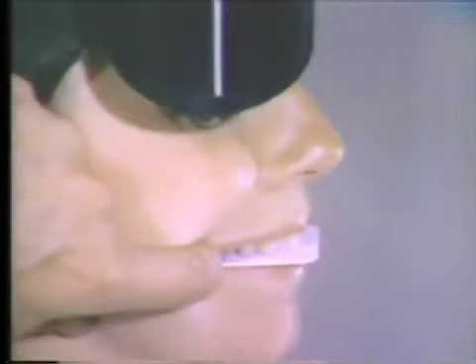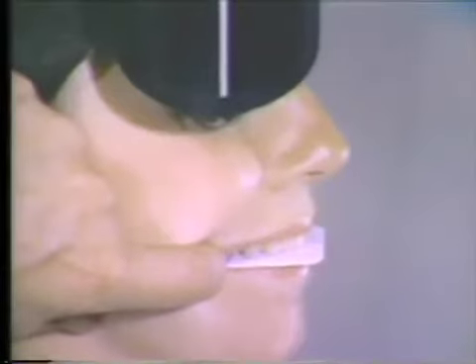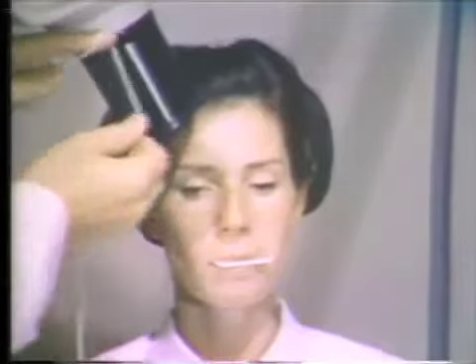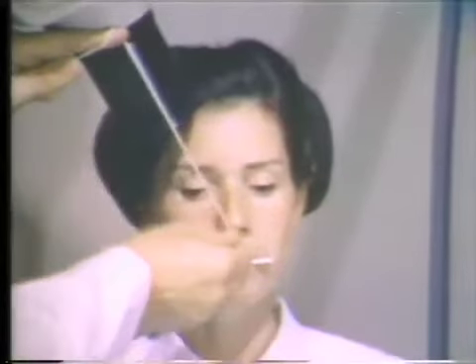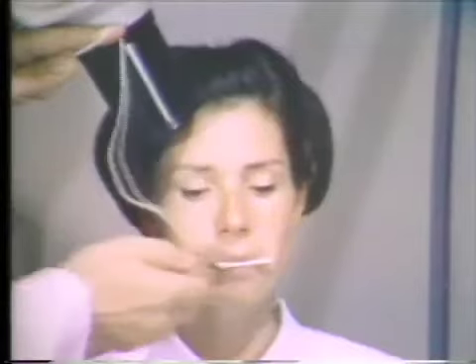The X-ray machine is now moved into position on the right side of the patient. The cone is directed so that the central ray will be aligned with the guideline that is visible on the lateral edge of the film. From the front, the cone must be positioned so that the central beam will pass through the guideline visible on the front edge of the film packet. The film can then be exposed.